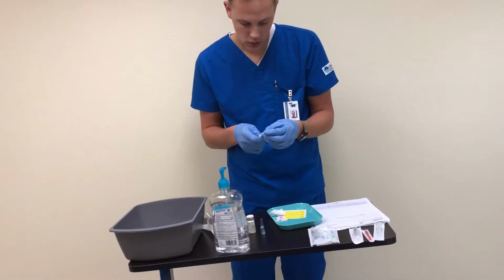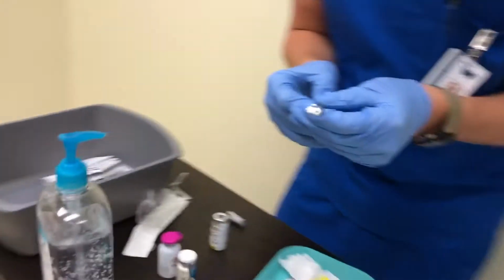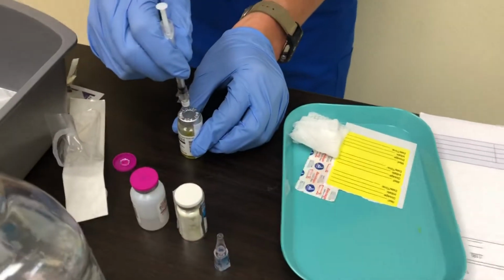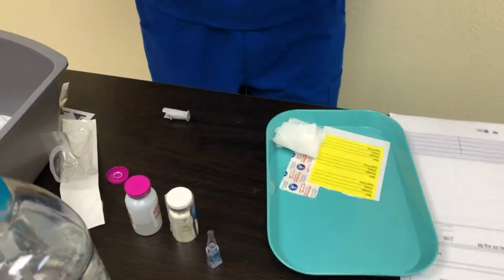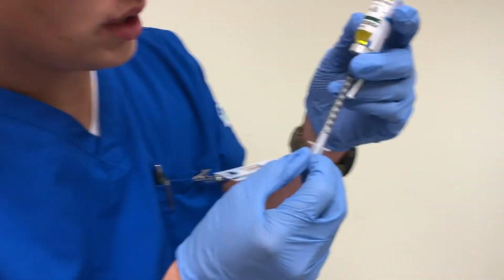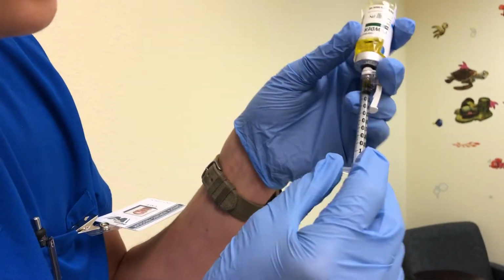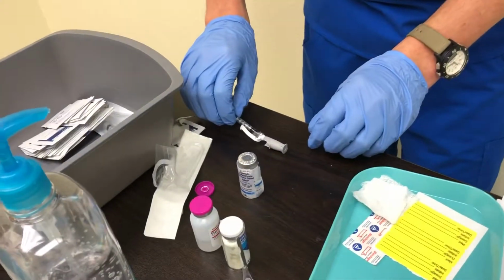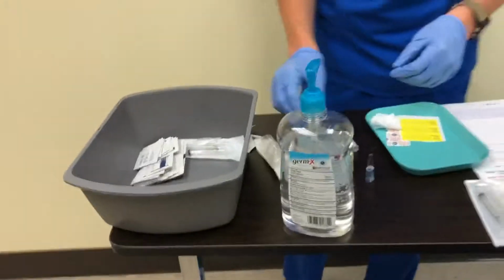Okay, so I'm just gonna uncap it and withdraw to 0.1 mils so that I have that air. So there's 0.1. And then I'm just gonna insert it into the med vial and squeeze that air in, and then invert the medication and pull out 0.1. And there we're at 0.1, so then we can pull that out and use the safety sweep and put that back on. Make sure we got it on, and then I can get rid of that vial.